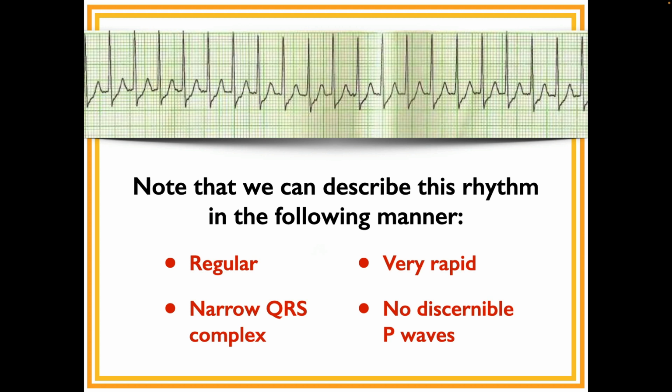Okay, so I had a question. You can either have the retrograde, the inverted, or the absent P waves. Would there be an instance like with WAP where you'd have all 3 in a 6-second strip, or would it always be either inverted or just absent? It would always be the same.